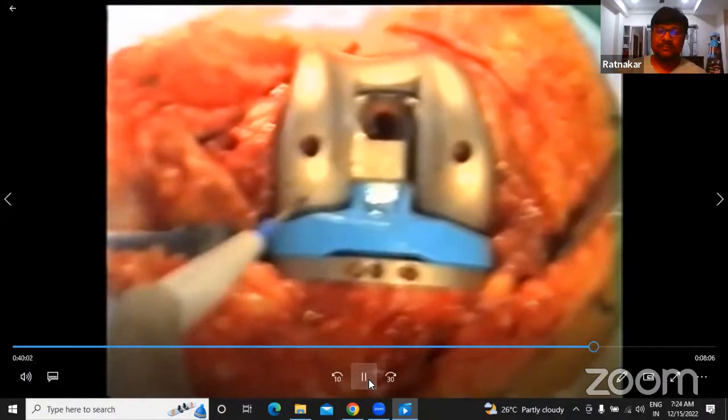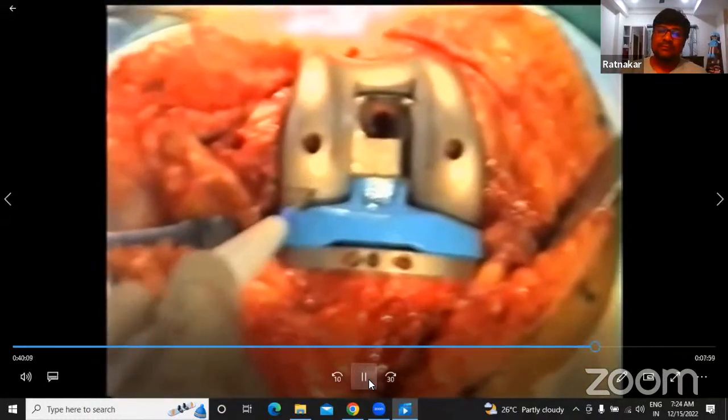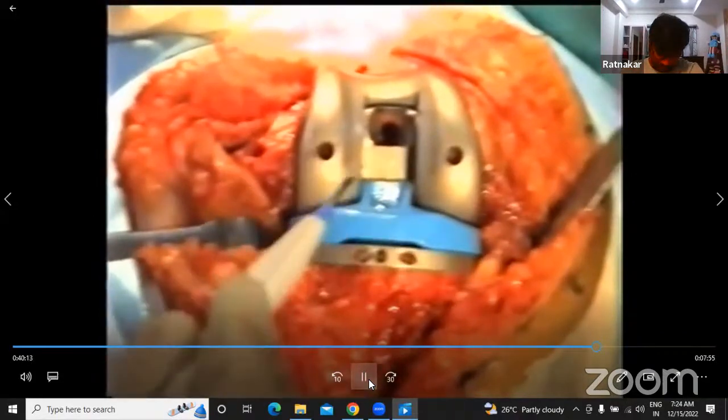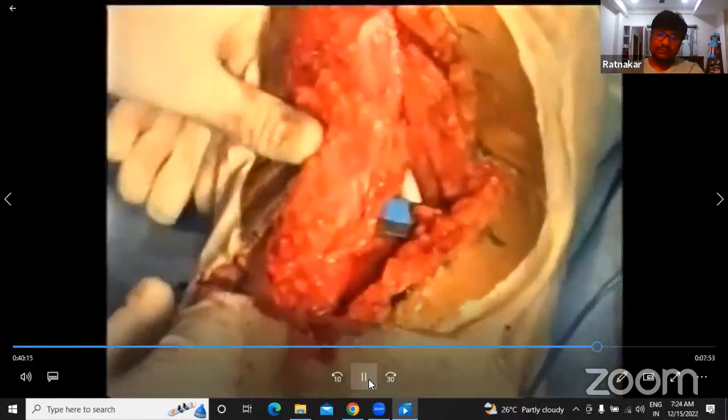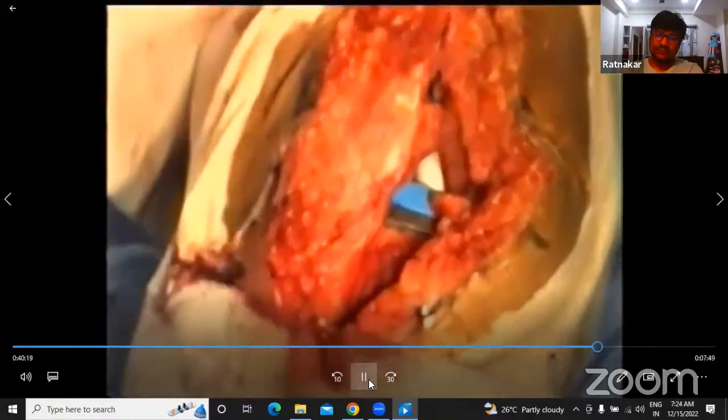Right. Now we can see, I have kept the knee in 90 degrees. This and this translation is exactly equal. There is no undue tension on this side or that side. That means the ligament balance is perfect. That is the patella. I'm putting the patella there and I'm not holding any thumb or anything there. And now we have to see.